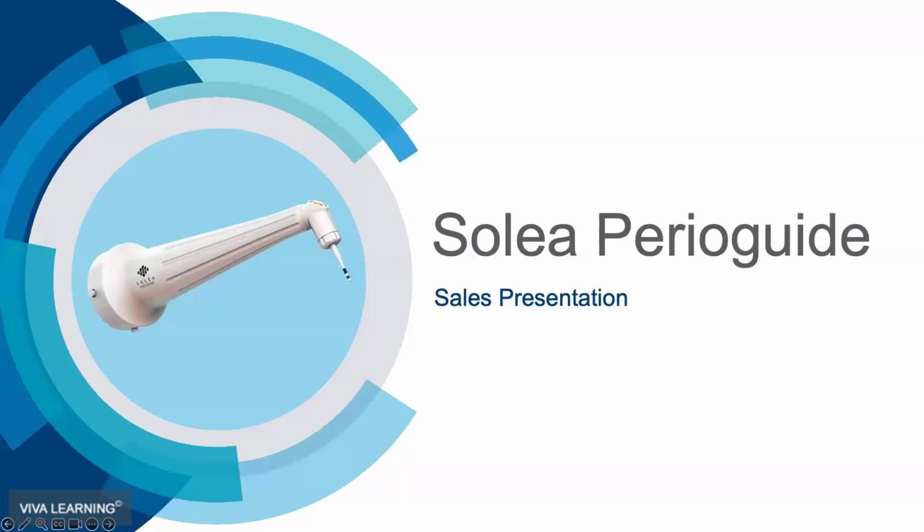Here's what's coming, and this is for perio. Now, I'm already using the traditional contra angle to do traditional pocket reduction surgery. Flap it with the laser, clean up calculus with the laser, reshape bone with the laser, remove granulation tissue with the laser. Just even degranulating takes what would be 45 to 50 minutes of scraping into 4 or 5 minutes of ablation. So it's incredibly efficient.